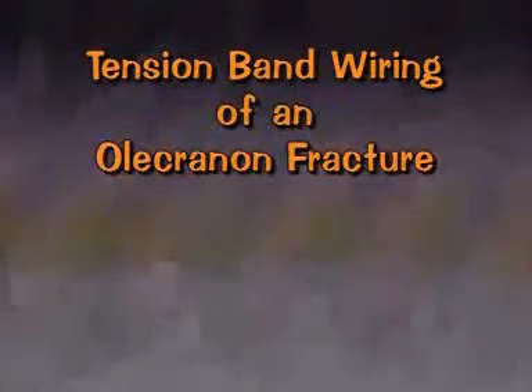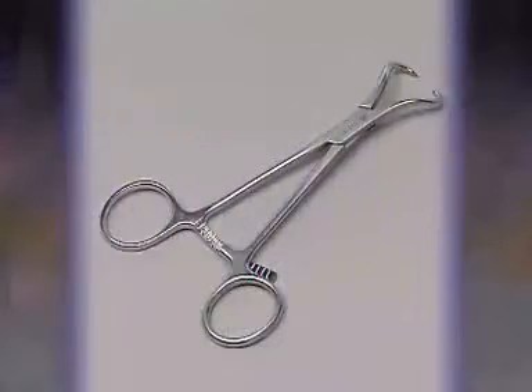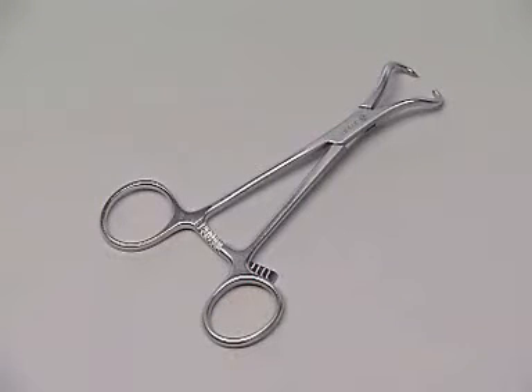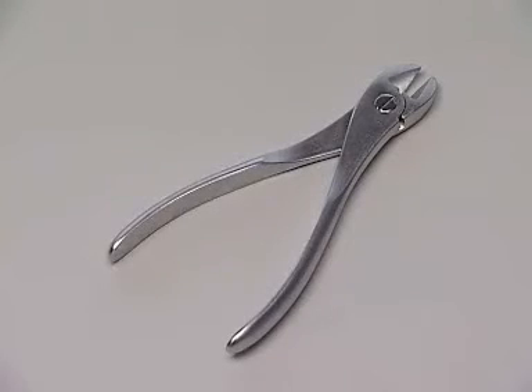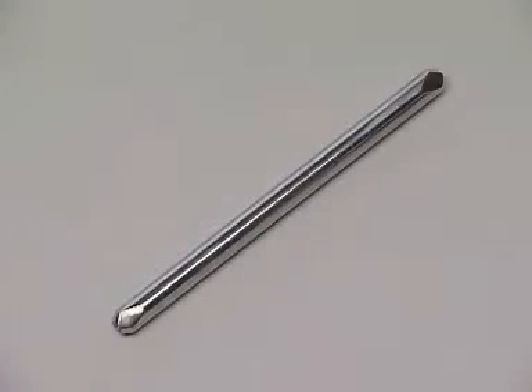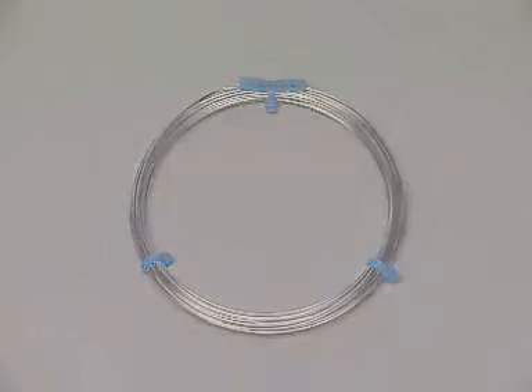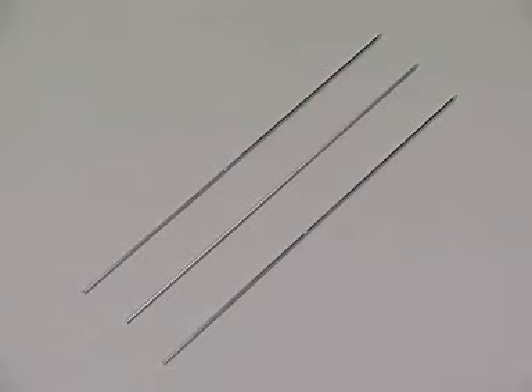You will stabilize a fracture of the olecranon with tension band wiring. The instruments and implants used for this exercise include the pointed reduction forceps, the small wire cutter, the flat-nosed parallel pliers, the bending iron for Kirchner wires, a coil of 1 mm wire, and three 1.6 mm Kirchner wires.